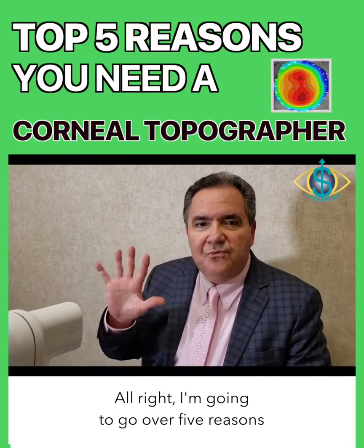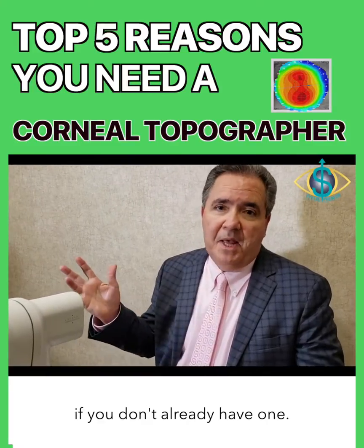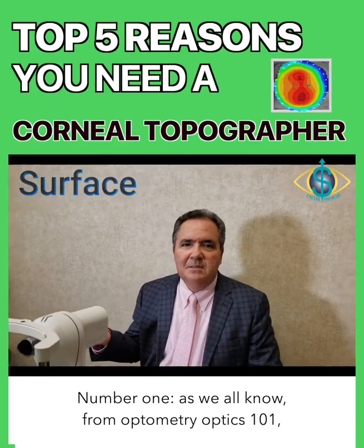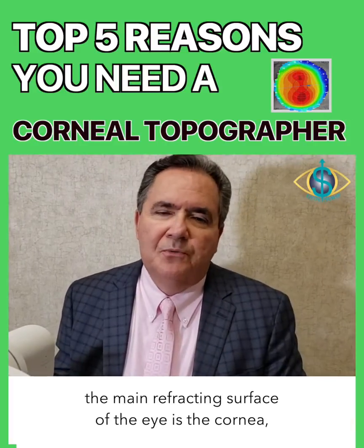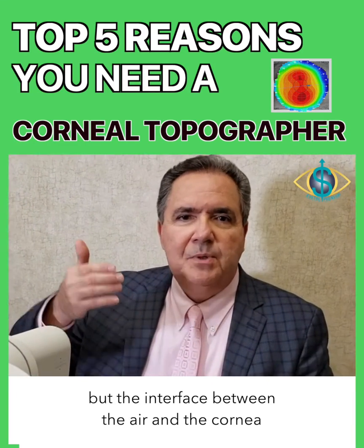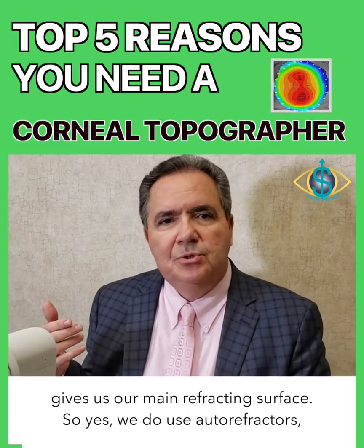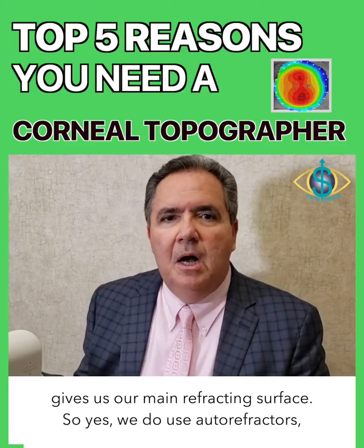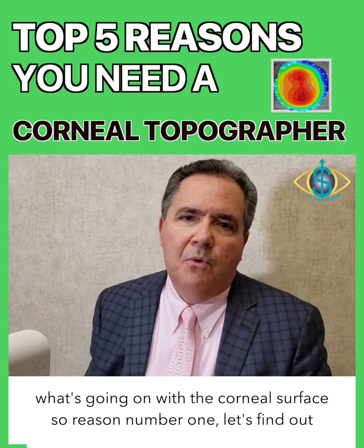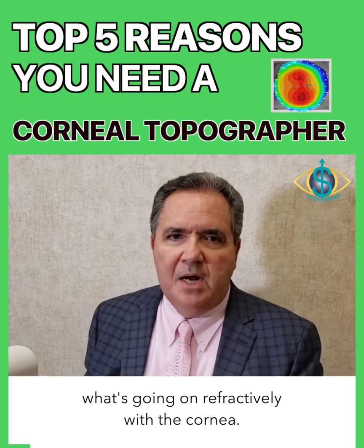All right, I want to go over 5 reasons that you should have a topographer in your office if you don't already have one. Number 1, as we all know from Optometry Optics 101, the main refracting surface of the eye is the cornea. So we're actually looking at the tear film, but the interface between the air and the cornea gives us our main refracting surface. So yes, we do use autorefractors, we use keratometers, but we need to really see what's going on with the corneal surface. So reason number 1, let's find out what's going on refractively with the cornea.